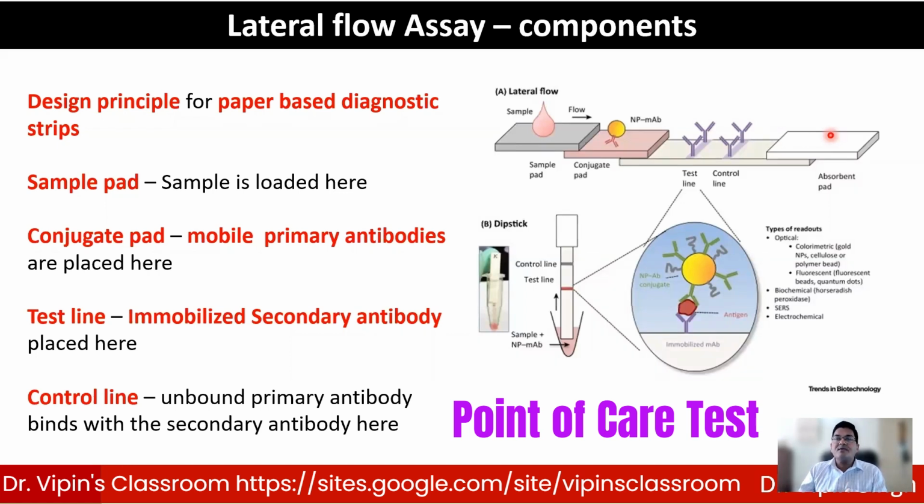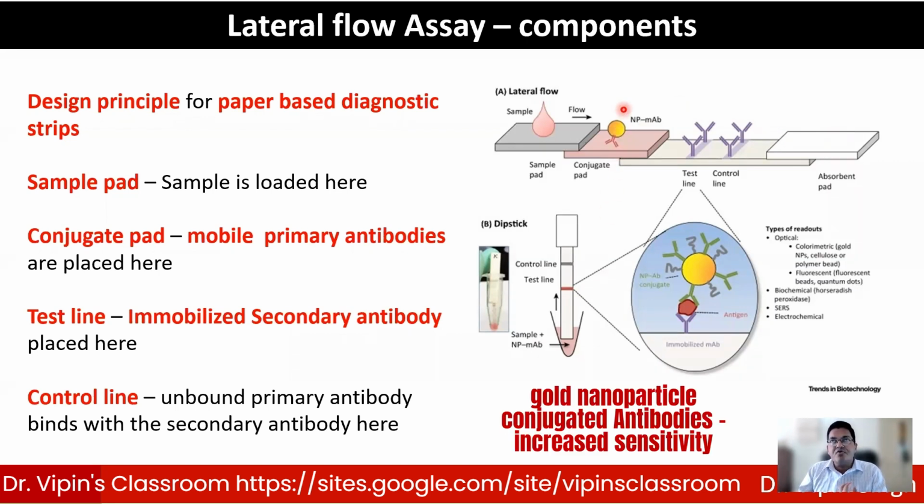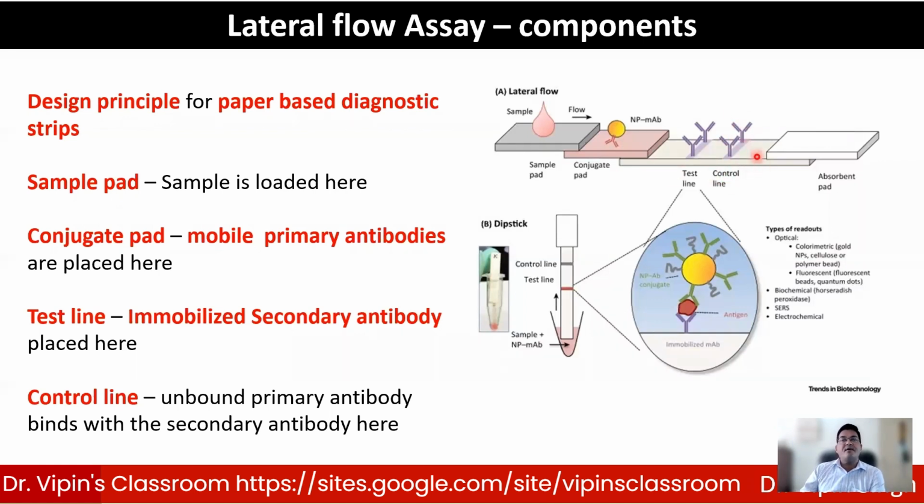And why does nanobiotechnology become important here? Because the use of antibodies conjugated to gold increases the sensitivity of the test. So the sensitivity of the test increases. And as I've shown you in the earlier reaction also, that allows nanoparticles to be used in this kind of ELISA assay. So this is basically an assay for development of color here, right? And here you're using fluorescent markers.